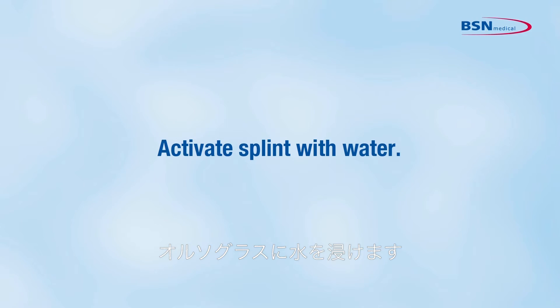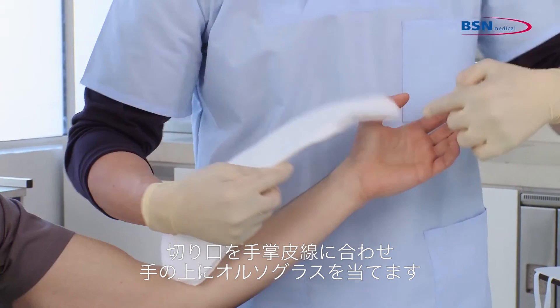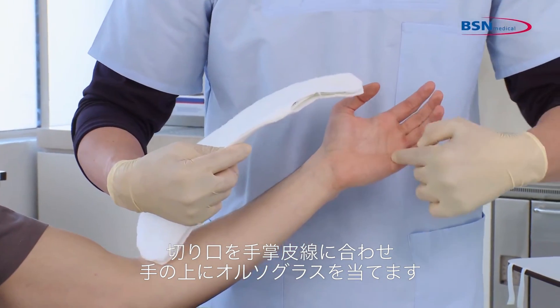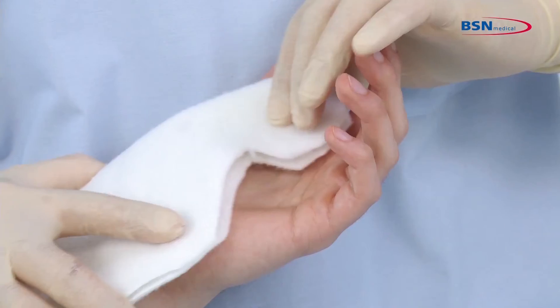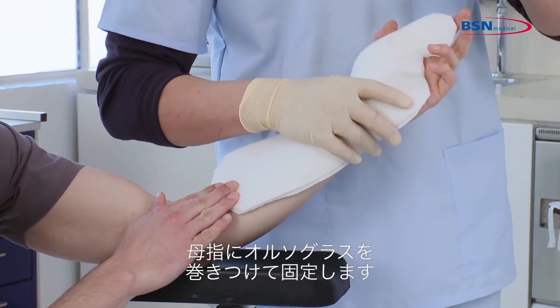Activate the splint with water. Place the splint on the patient, making sure the splint lines up with the palmar crease. To find the right position, take the thumb portion and wrap it around the thumb.